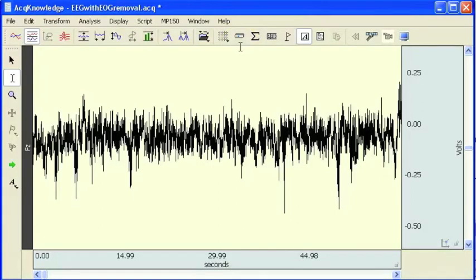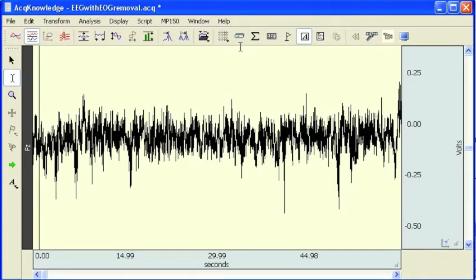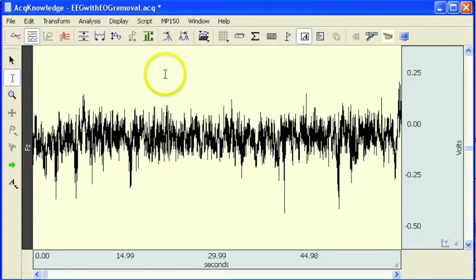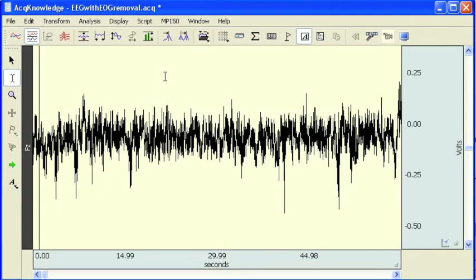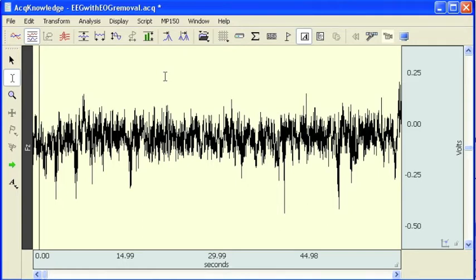The following screencast will demonstrate how to use AcqKnowledge's automated frequency analysis tool. This particular tool will determine the mean power, median frequency, mean frequency, spectral edge, and peak frequency over a user-defined time interval.